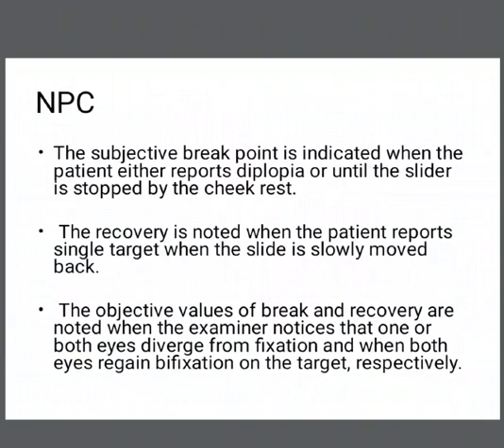The objective values of the breakpoint and recovery point are noted as follows: when the examiner notices that one or both eyes diverge from fixation, it is recorded as the breakpoint, and when both eyes regain bifixation on the target, it is recorded as the objective recovery point.